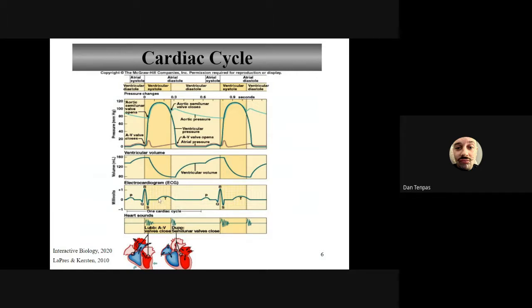Moving into the T wave. The T wave is right here. T wave is when we have ventricular repolarization. The ventricles will eventually relax, dropping ventricular pressure. We do see a drop in pressure during that T wave. The valves close, causing isovolumetric relaxation. And with this relaxation, ventricular pressure is going to drop significantly.